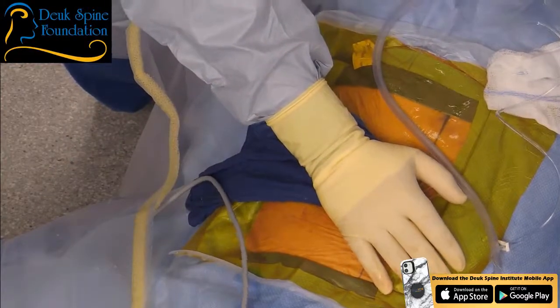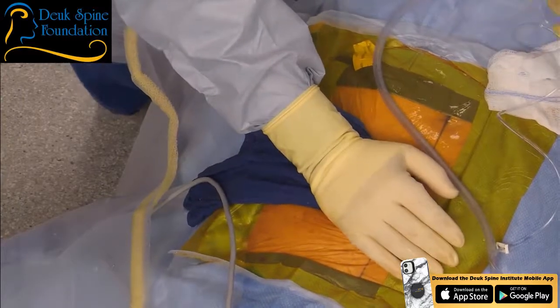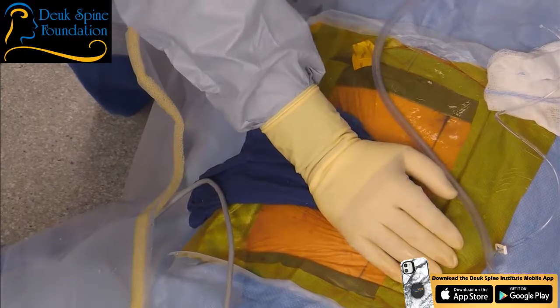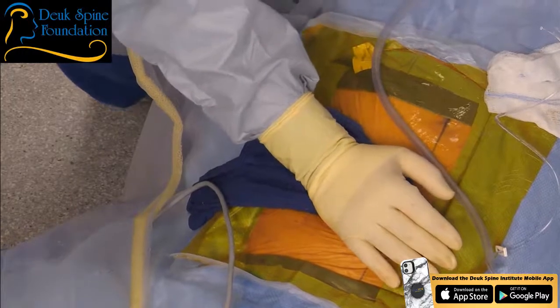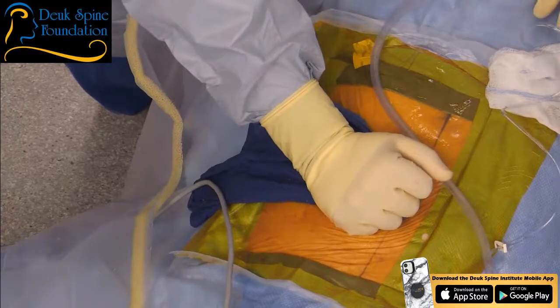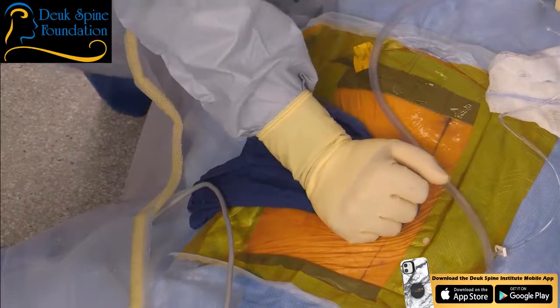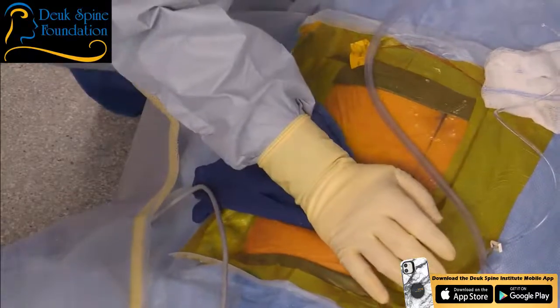It wasn't blue because the dye only stains nucleus pulposus, and to stain the nucleus pulposus that's stuck in the tear, the dye has to reach it. Because the tear had partially healed so well with all the scar tissue, the collagen of the scar tissue walled off the nuclear material, preventing it from getting stained. And scar tissue is white. That's why everything appeared white.